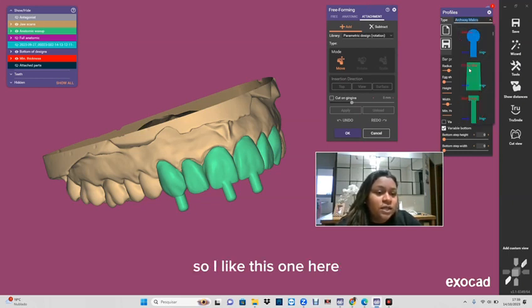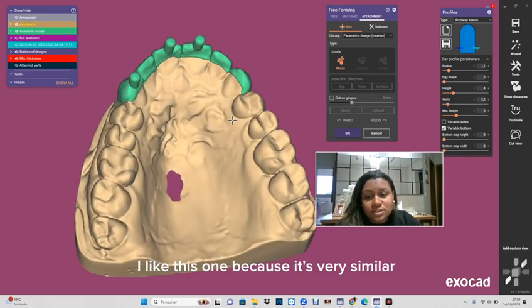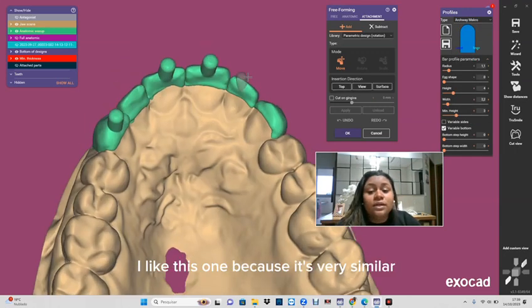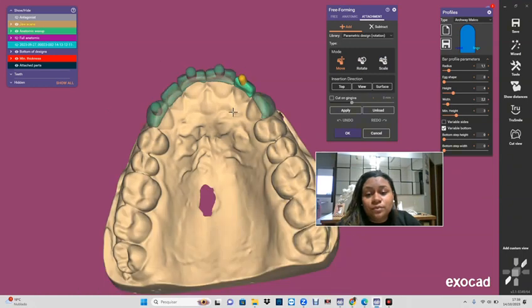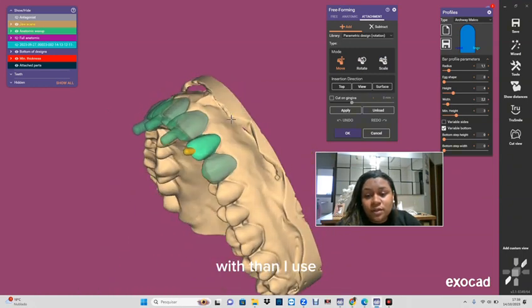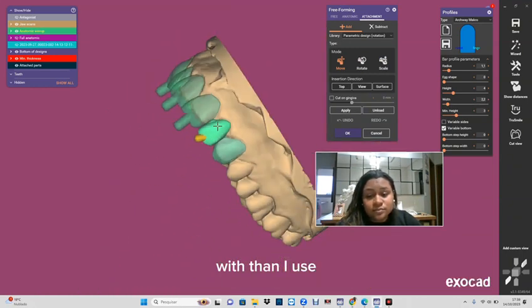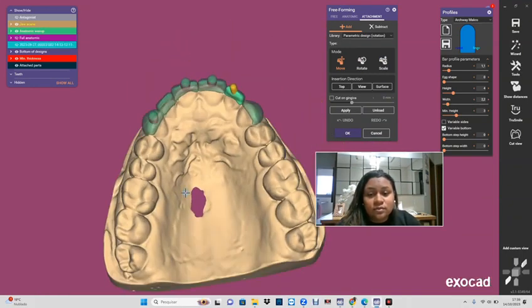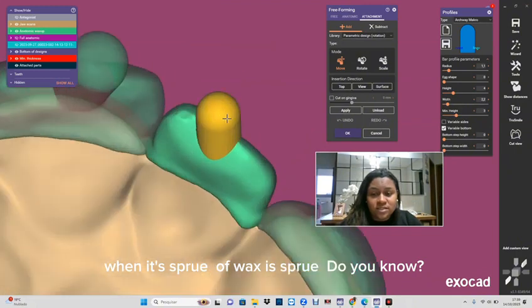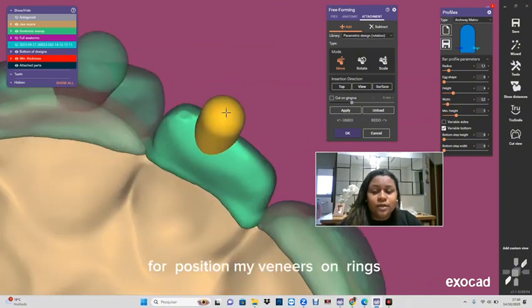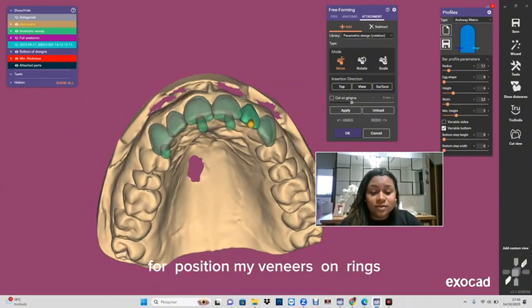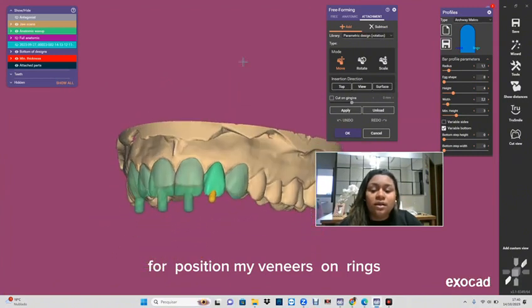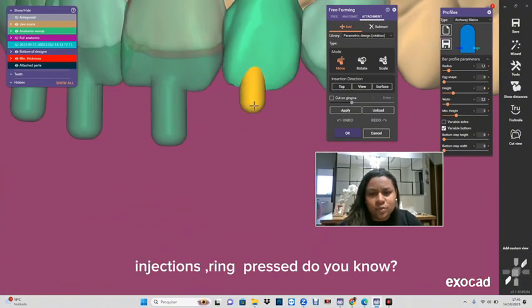So I like this one here. I like this one because it's very similar with the wax sprue, you know, the sprue for positioning my veneers in press systems. And you know, so it's very easy.